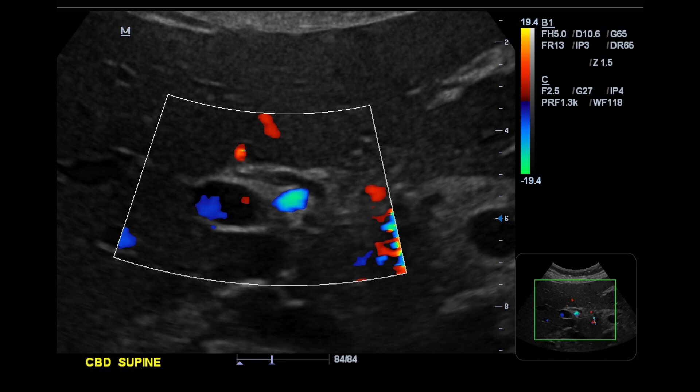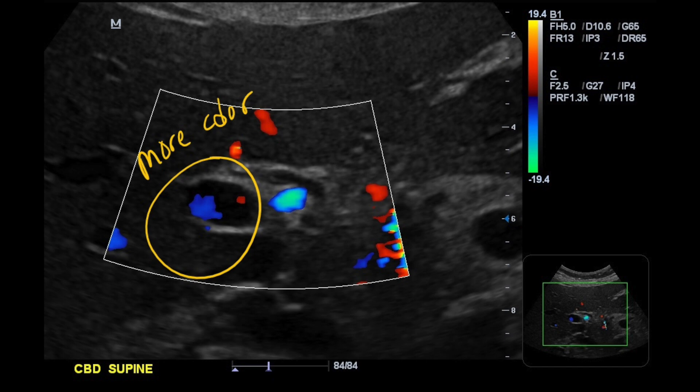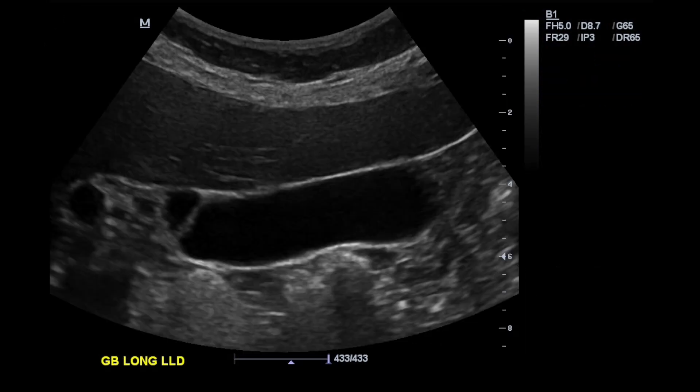We take a measurement of the CBD at the hilum and at the pancreas head, then we use color Doppler to prove we're looking at the CBD. The flow of bile through the CBD is too slow for color to pick up, but surrounding vessels should show flow fast enough for color — that's how we distinguish the CBD from, say, the hepatic artery. My instructor's note here says there needs to be more color in the portal vein to prove that the CBD actually is the CBD.